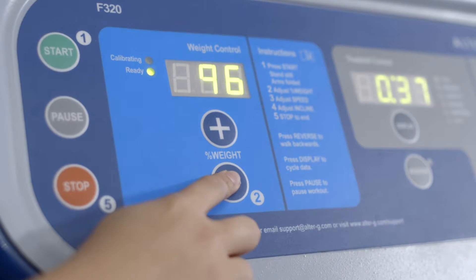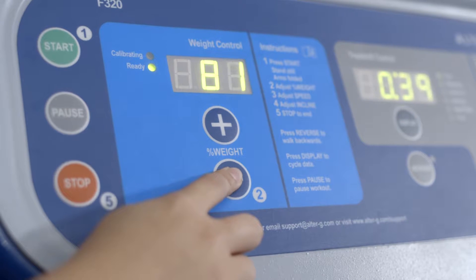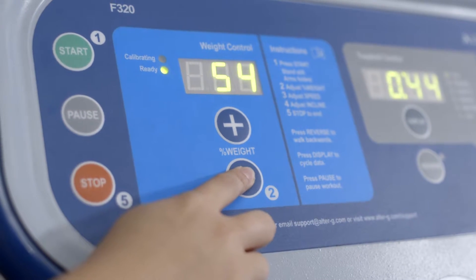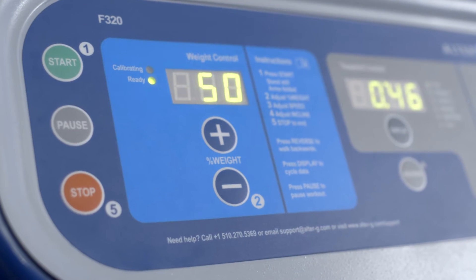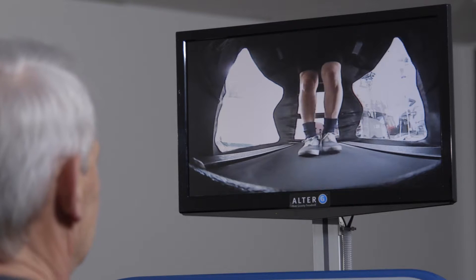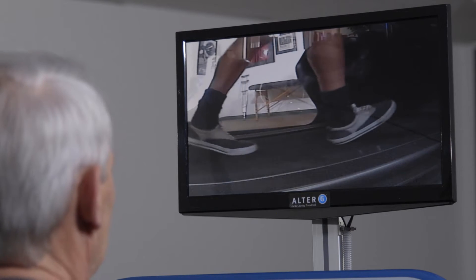The amount of body weight support provided should be specific to the patient's level of pain. Begin by unweighting a patient to about 50 to 60 percent. Add or remove body weight support until the patient is able to walk pain-free. The video monitoring system should be used to provide your patient feedback on their gait mechanics.